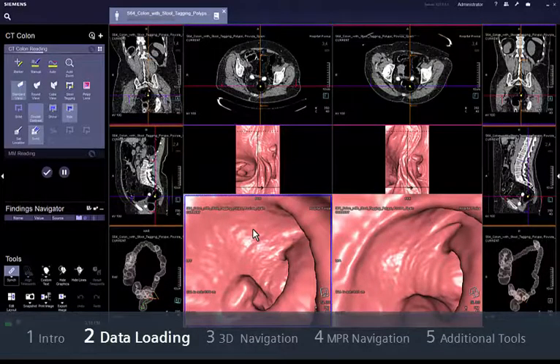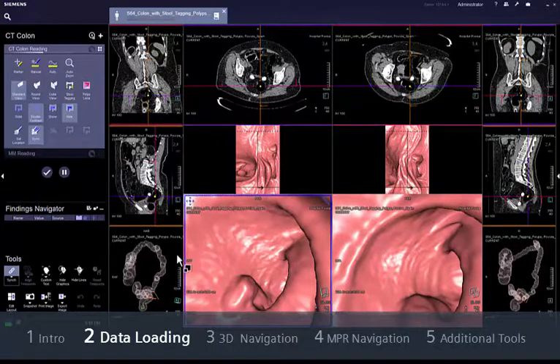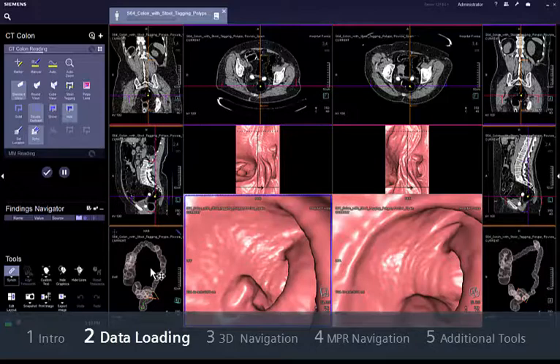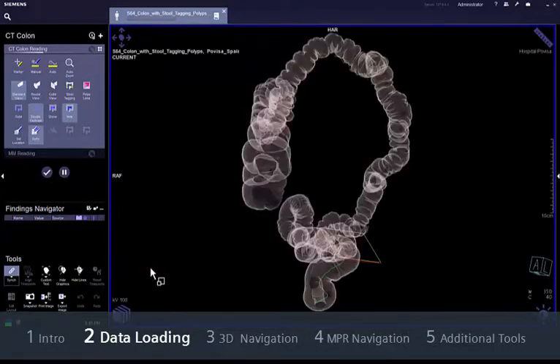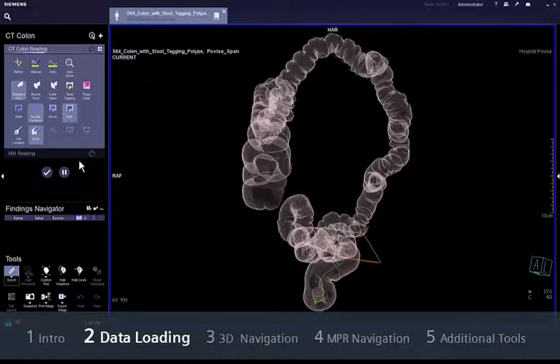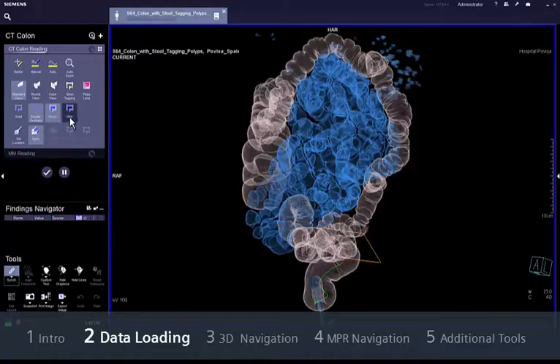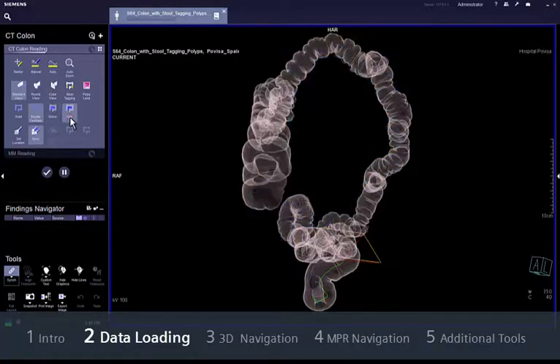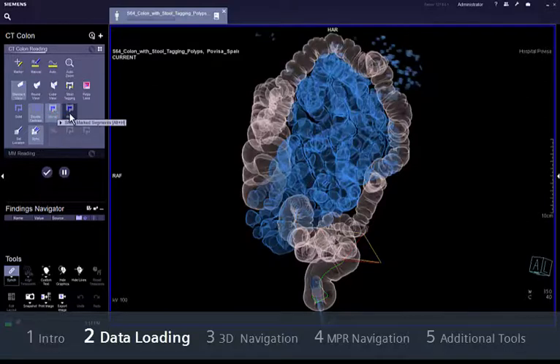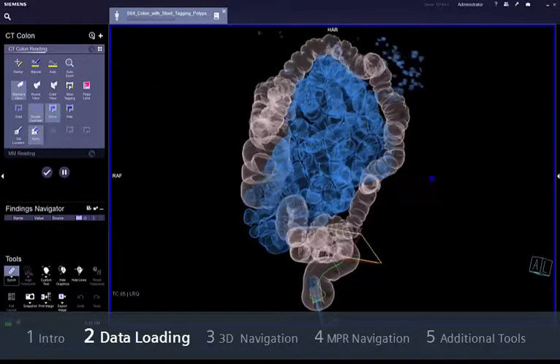The synchronisation of the supine and prone data sets is based on the automatic segmentation of the small and large bowel in both series. To ensure proper synchronisation, check that both the large bowel, shown in white, and the small bowel, shown in blue, are correctly recognised in the global view segment.